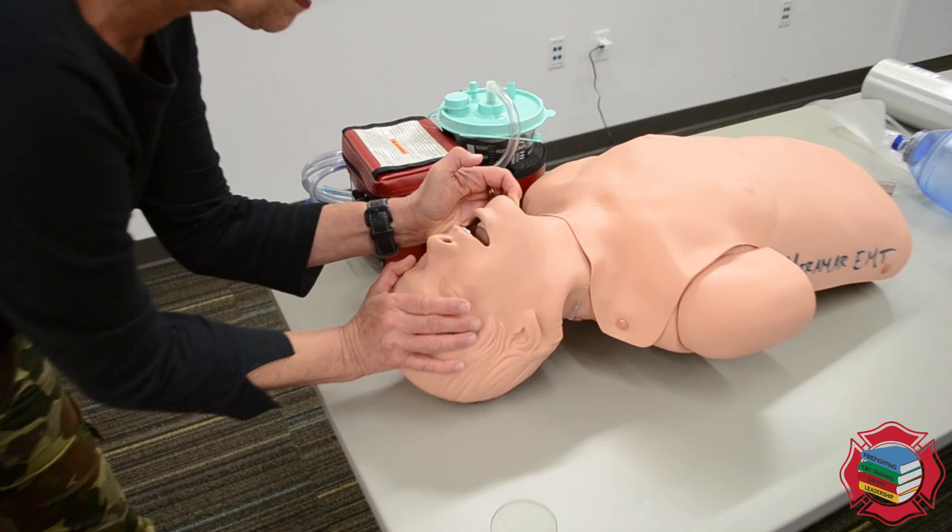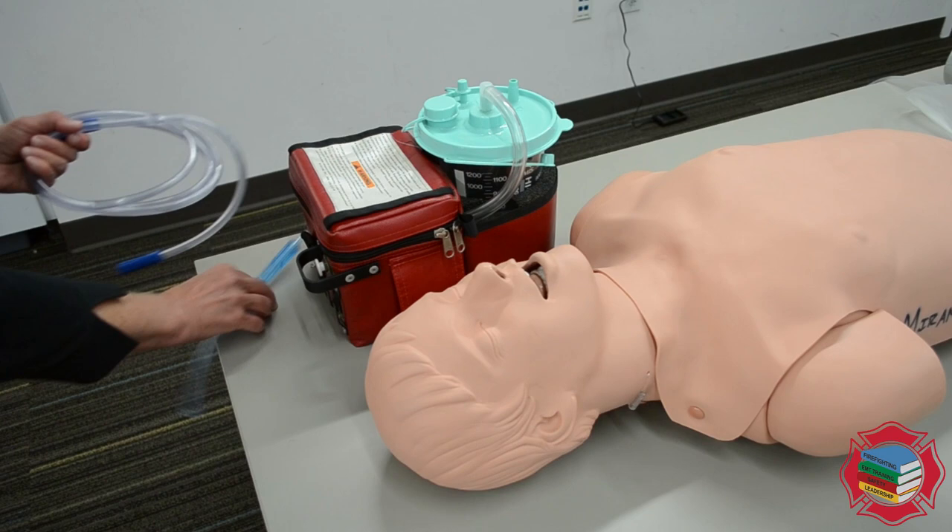Now I'm going to go up to the head and open the airway with a head-tilt chin-lift. I see vomitus in the mouth and I'm going to prepare to suction.